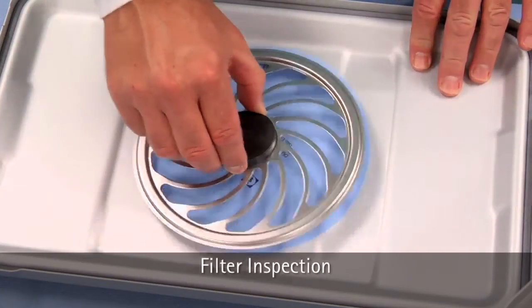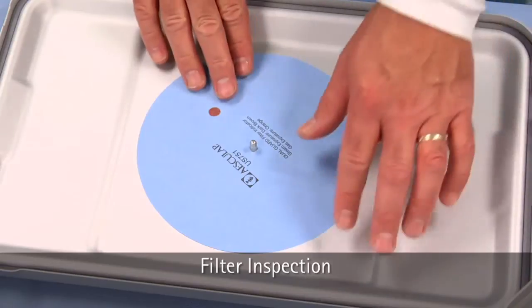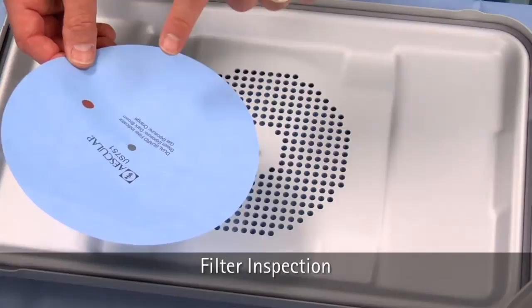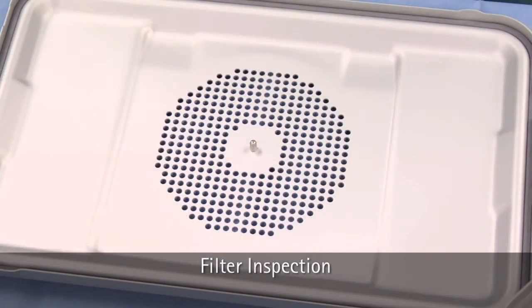Remove the filter retainer plate by pressing in on the two tabs and lifting. Check the filter for integrity. If the filter is damaged, you should consider the set not sterile. Discard the single-use disposable filter after checking for integrity.